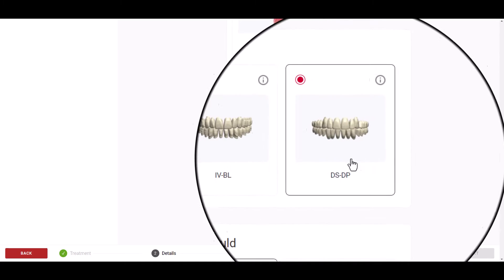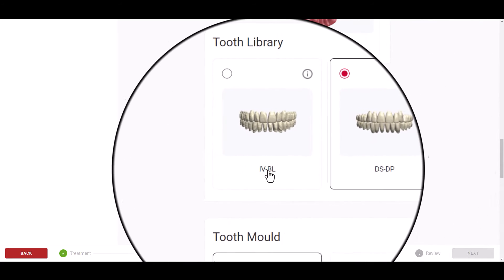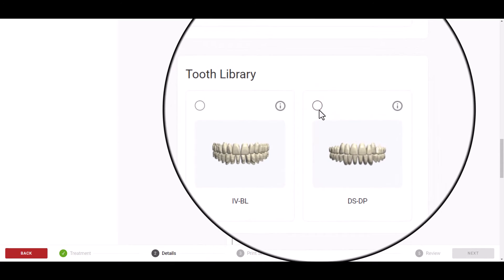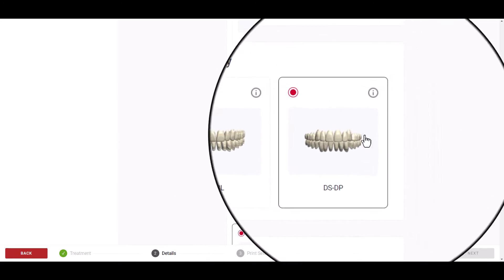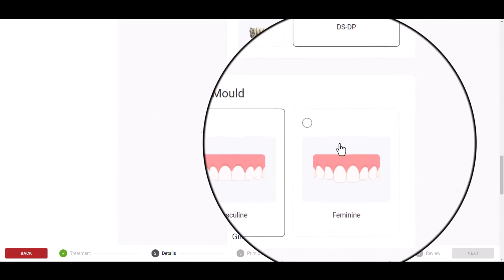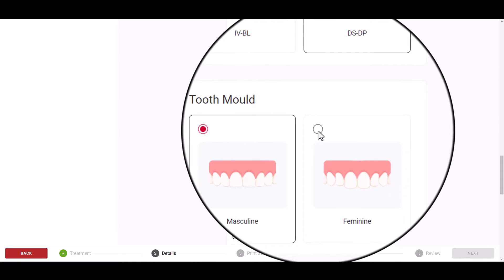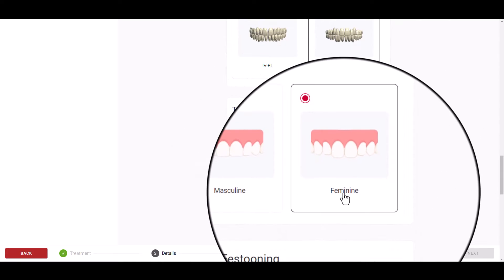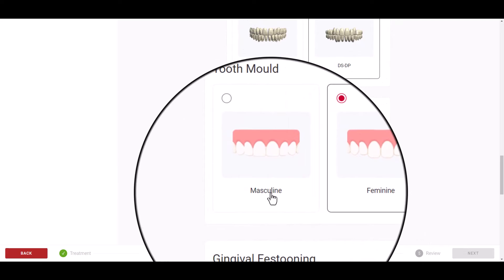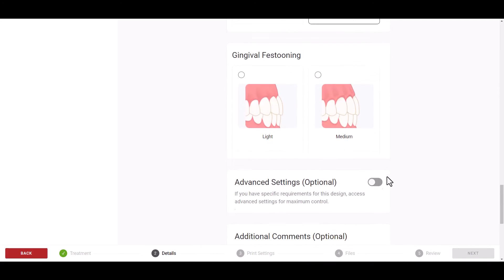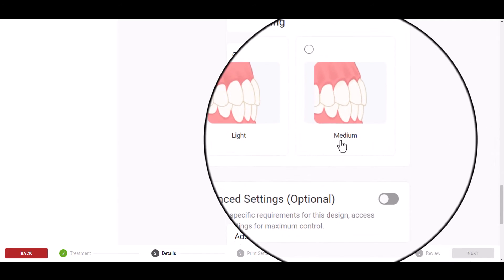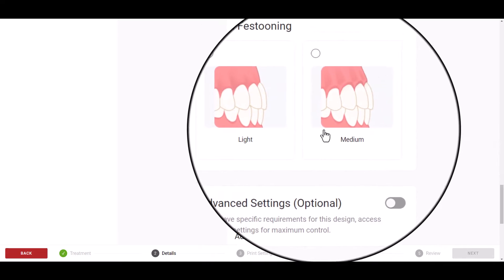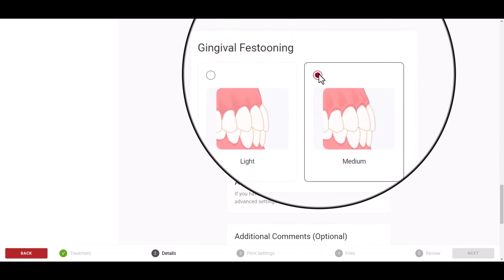When selected, if you scroll down, you will see the options for the tooth library, as well as the options for the tooth mold, whether masculine or feminine. And finally, the option between light or medium gingival festooning.